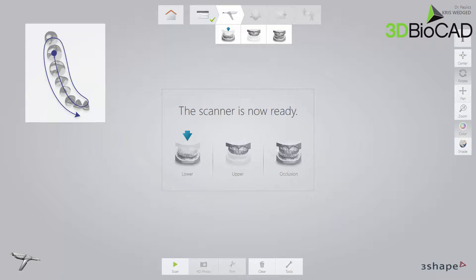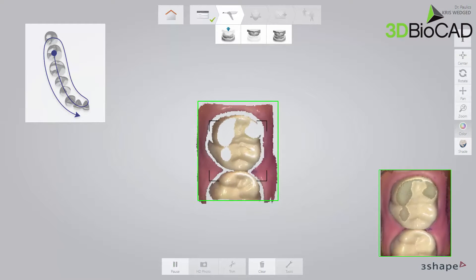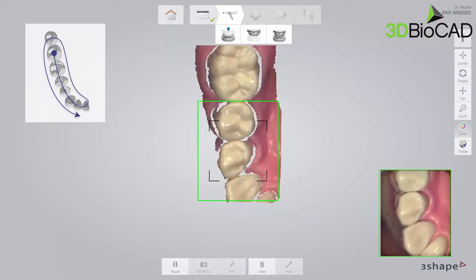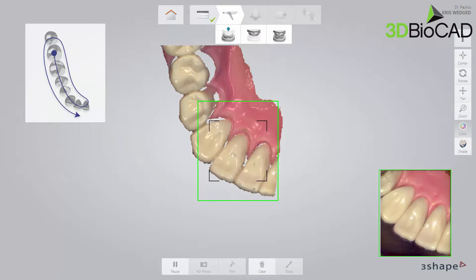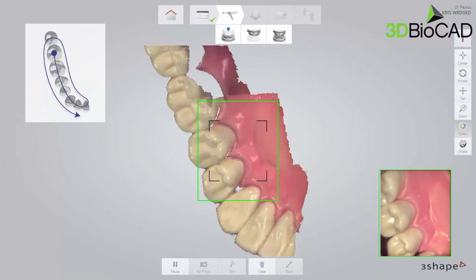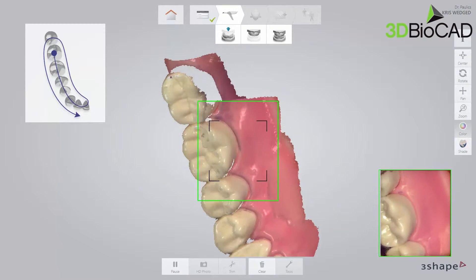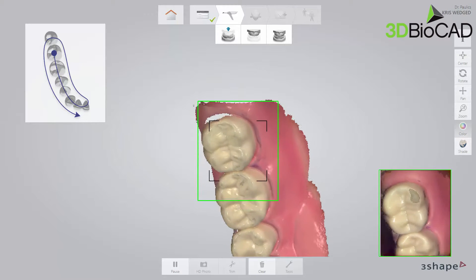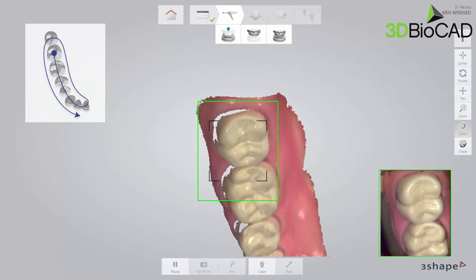Follow the official scan strategy: scan the occlusal surface from the molar to the canine. Then, as it is the lower arch, slowly roll to the lingual side and move the scanner in the distal direction. Finally, slowly roll over the last molar and scan the buccal side.